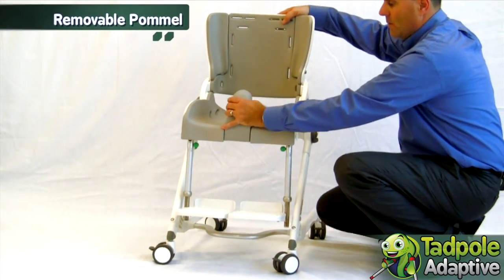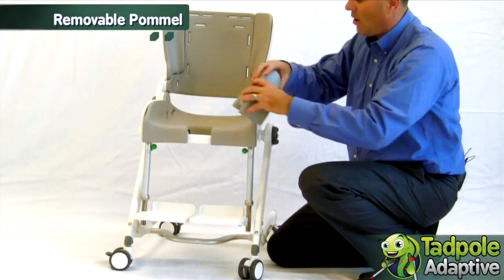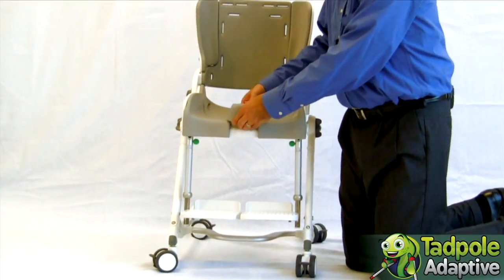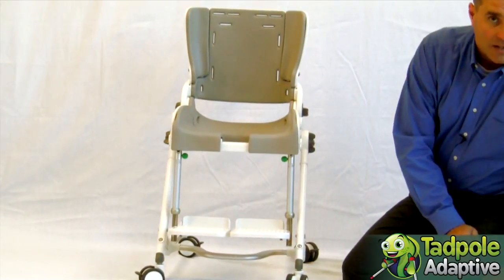The Flamingo has a removable splash guard pommel available in two sizes: the tall for boys, and the short that can be more appropriate for girls or when abduction of the legs is not needed.